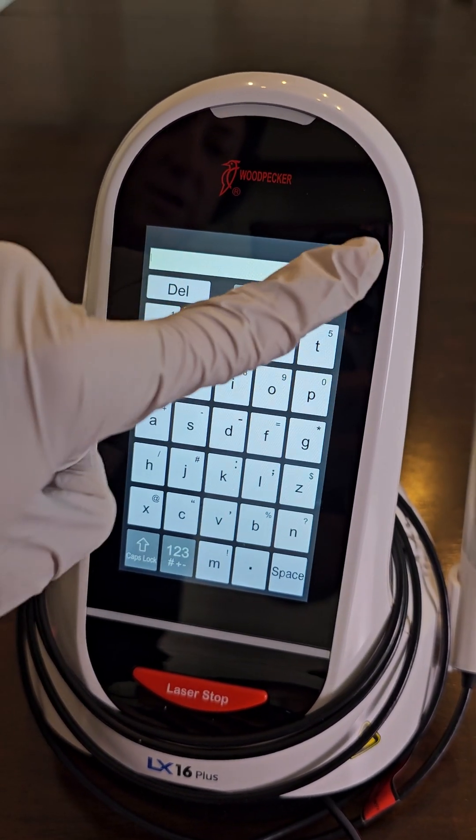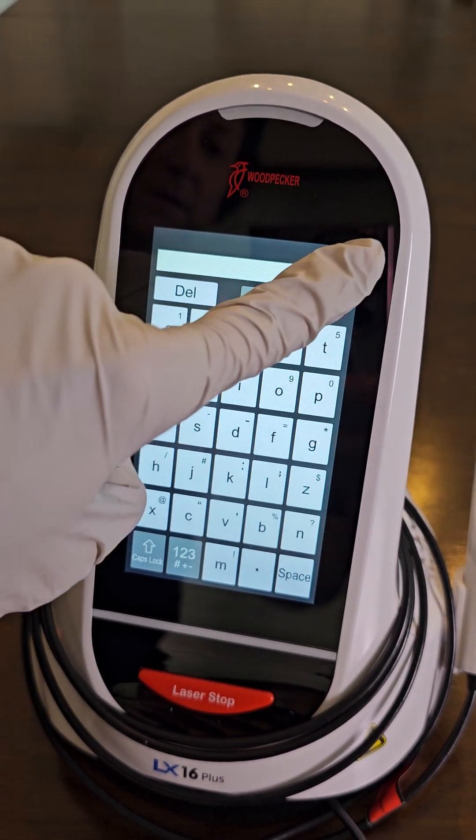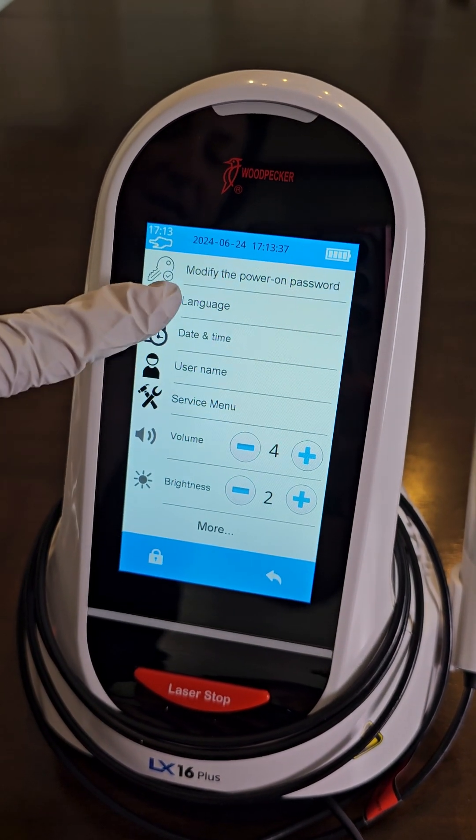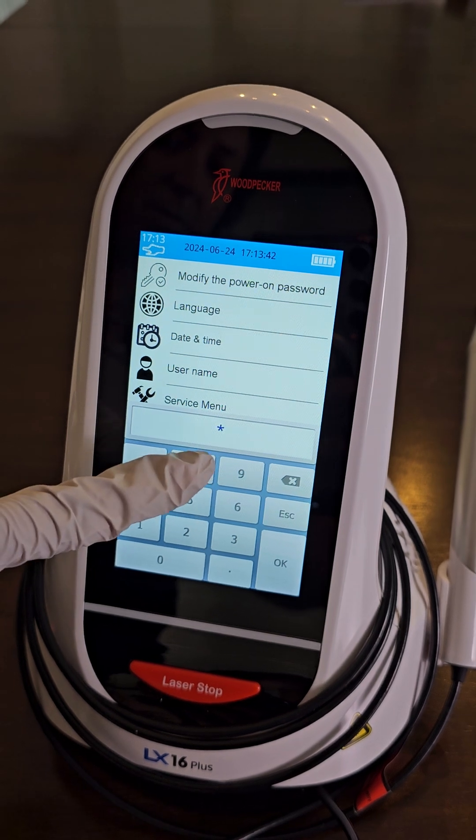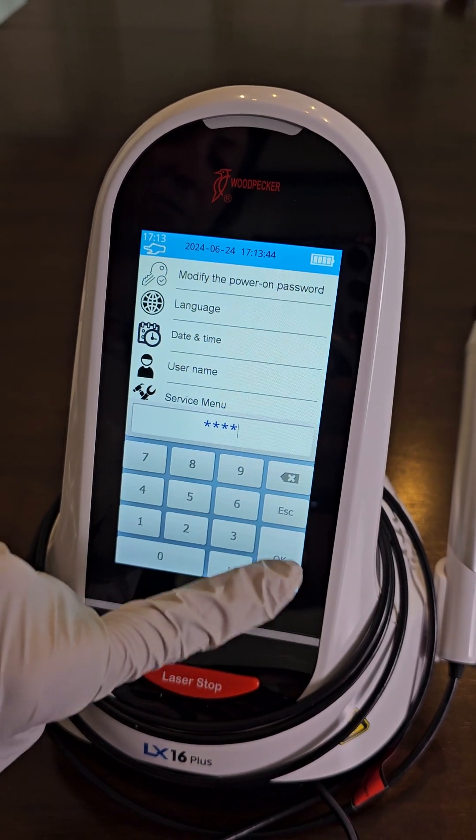In settings, you can change the user name, date and time, language, and also you can modify your password if you wanted a different four-digit code.